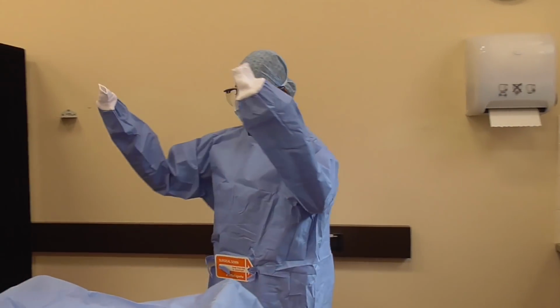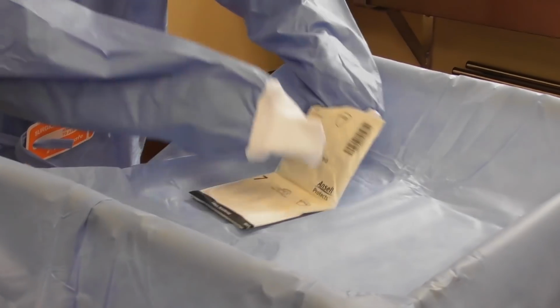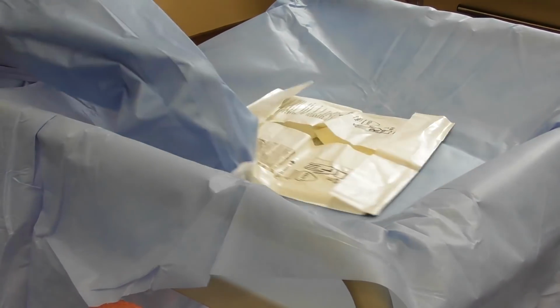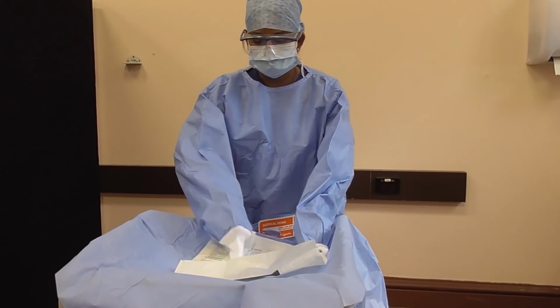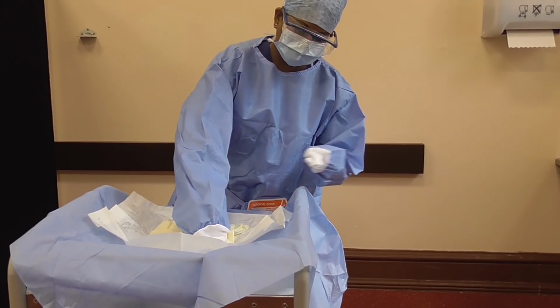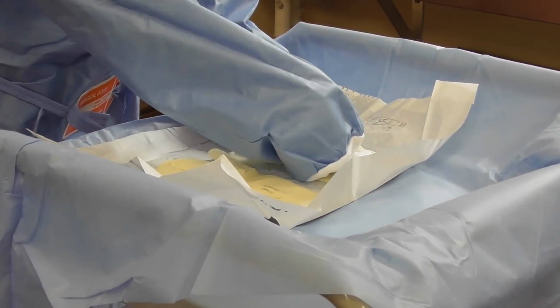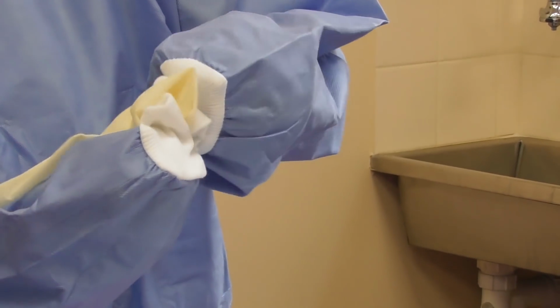With the cuffs covering your fingers, carry out the closed gloving technique. Firstly, unfold the glove packet and maneuver it so that the fingers are facing towards you. Using your dominant hand, place your hand on the appropriate glove and pick it up with your thumb under the folded part of the glove. Flip it over onto your hand and maneuver your fingers into the glove.